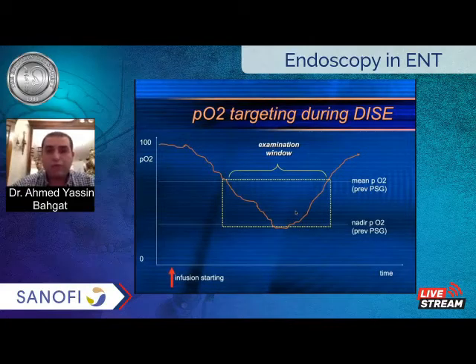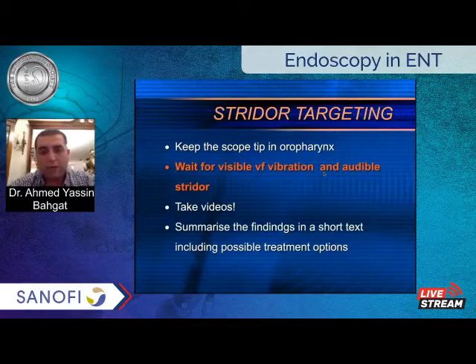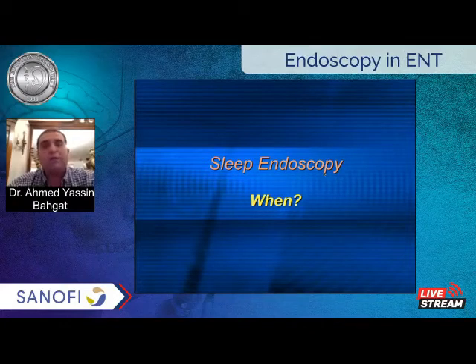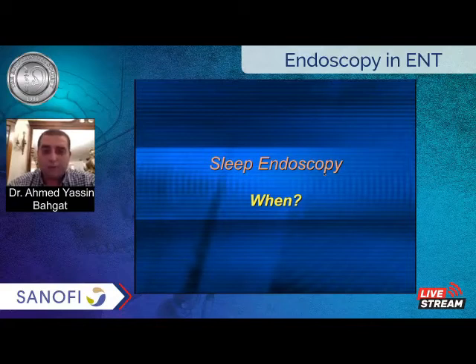In case of stridor, if the patient is complaining mainly of stridor, we wait for the vocal cord vibration and audible stridor. Look at the vocal cord mainly. Do we do sleep endoscopy for all cases? In my experience, I do them for all cases. In all sleep surgeries, even if I diagnose them with the awake examination and the patient has big tonsils, adenoid, whatsoever, before going into surgery, at the same setting, I ask the anesthesiologist to give the patient propofol, induce sleep, and do it.